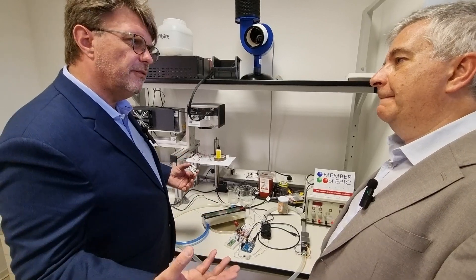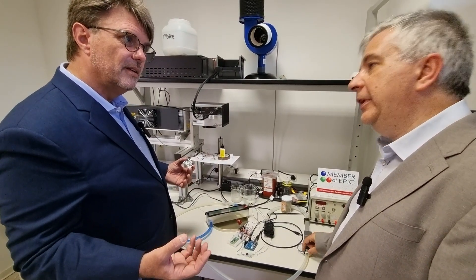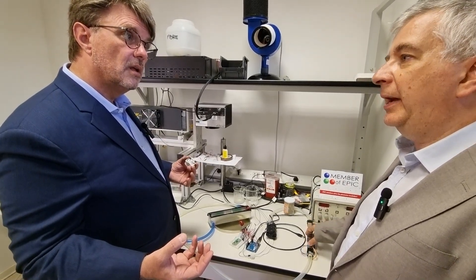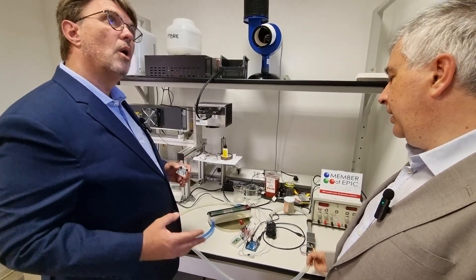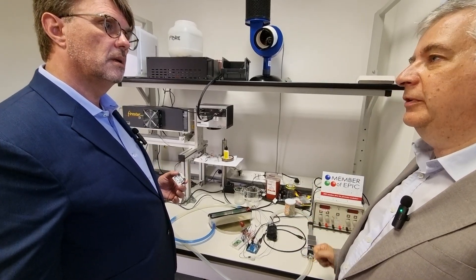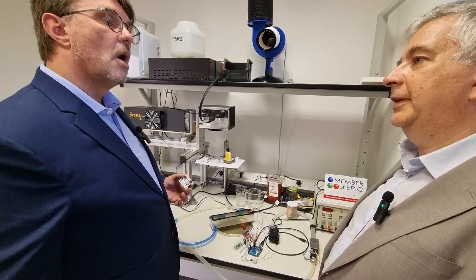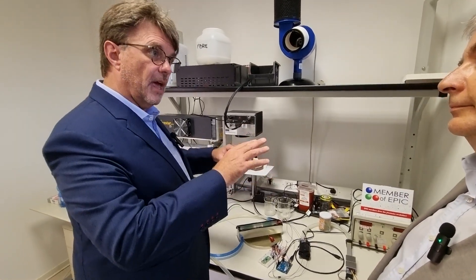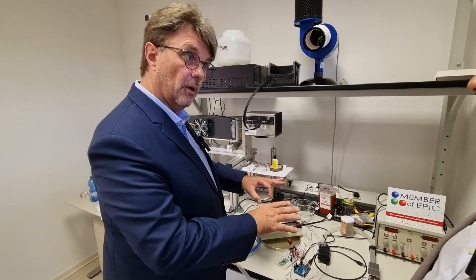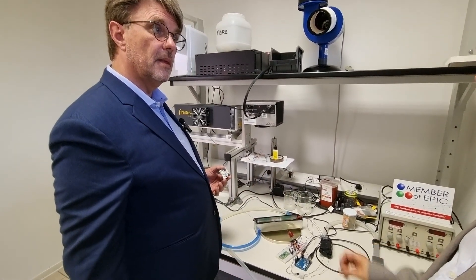We do this with UV and blue light, depending on the situation — with a proprietary mixture that has a patent pending on it. We use different colors to optimize the result, essentially optimizing the output spectrum of the sterilization device depending on the use case.